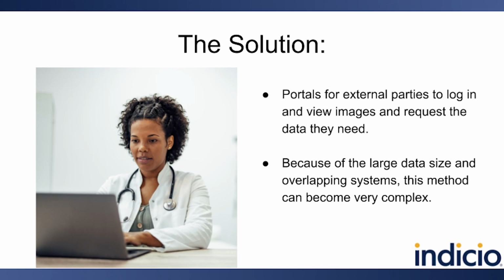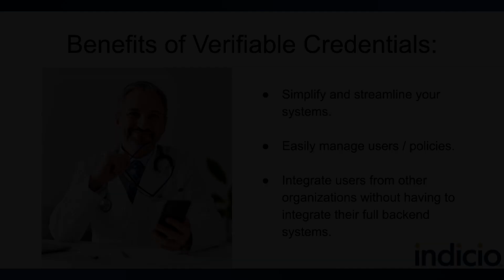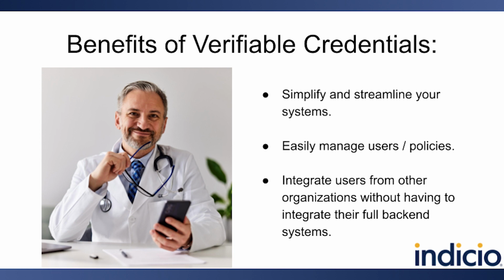And so often the holders of this data, these health systems, will build portals that allow external parties to log in and then view each other's data and request just the bits that they need. Because of this large data size and the overlapping systems, you end up with things that can get kind of complex. So we thought, can we grant permissions on the basis of data contained in a verifiable credential?